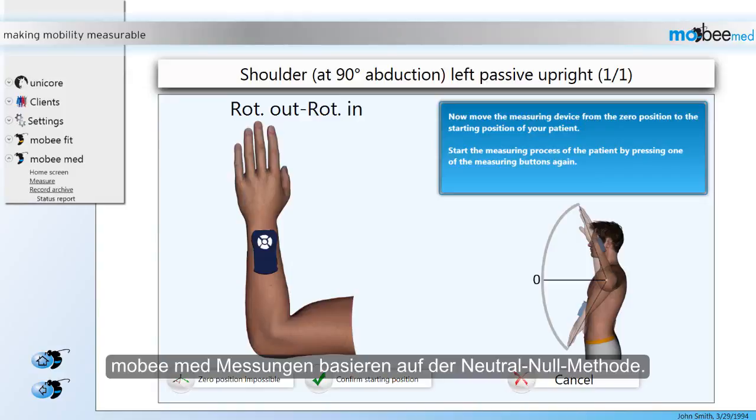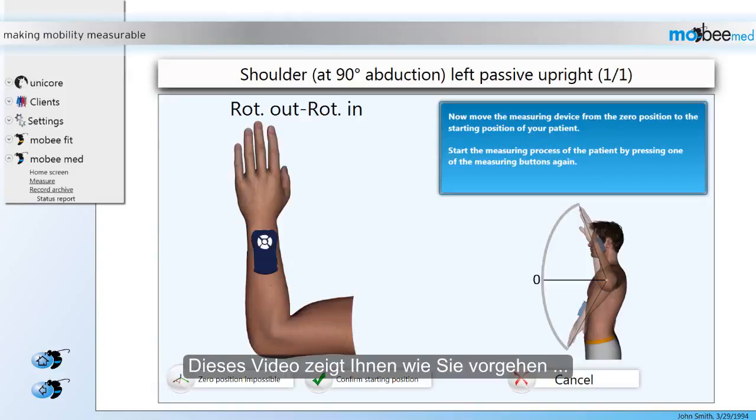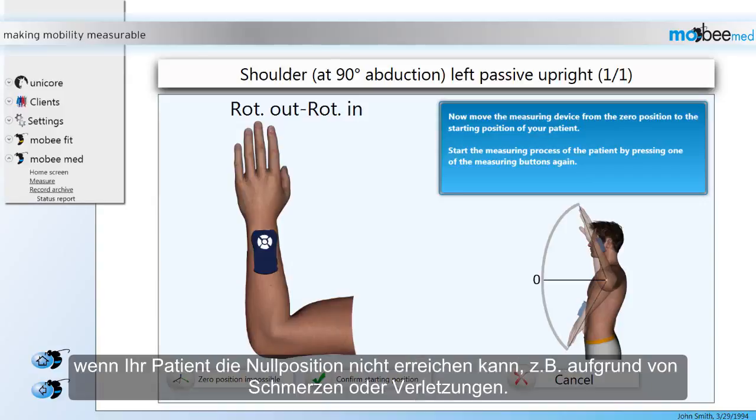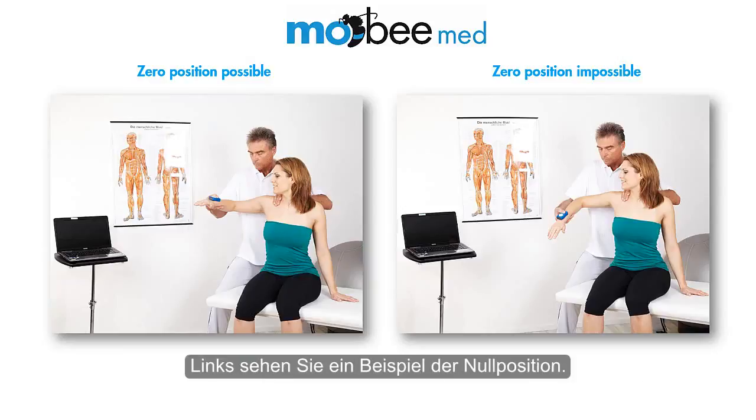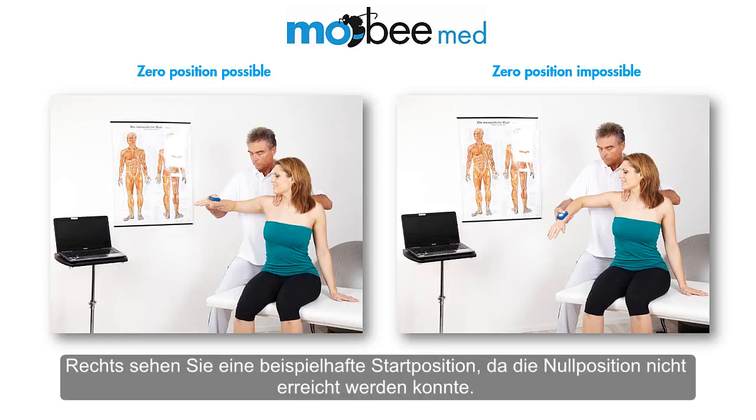MobiMead measurements are based on the Neutral Zero method. This video is going to show you what to do in case your patient cannot reach a zero position due to pain or previous injuries, for example. Here is a quick illustration of the shoulder measurement. On the left hand side you can see an example of what the zero position should look like. On the right is an example of a starting position due to an impossible zero position.